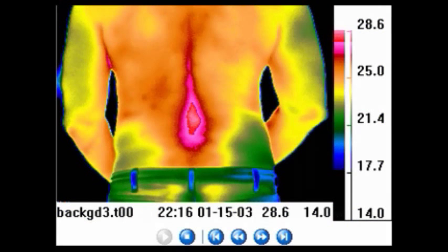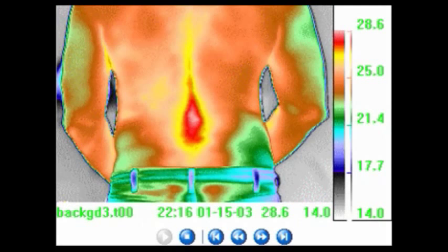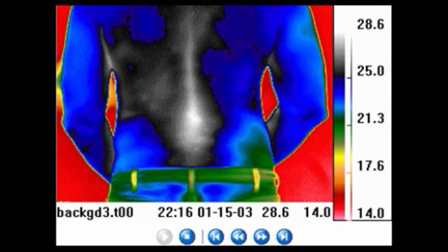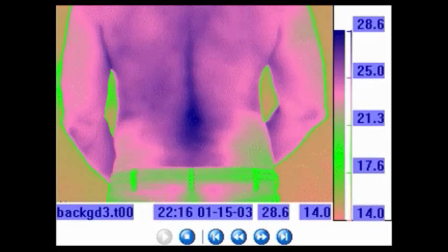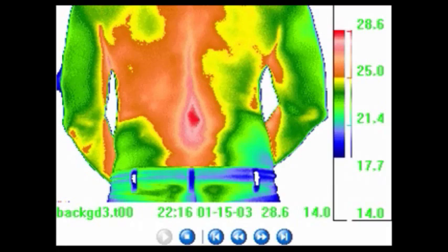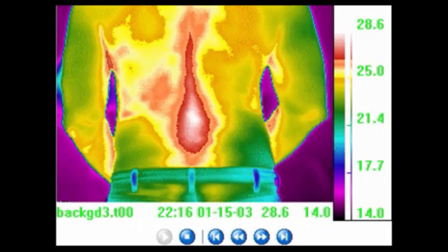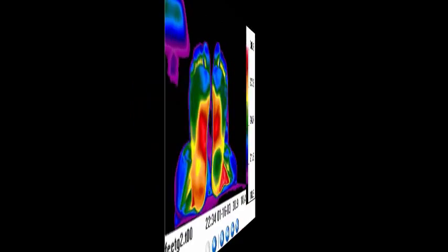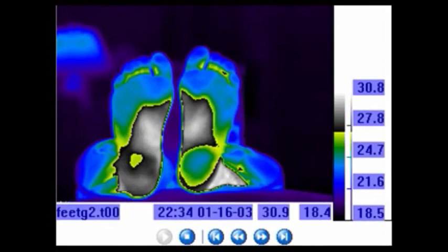Most infrared camera companies are very limited with their choice of available palettes. They usually only have a few standard choices and don't permit any flexibility.